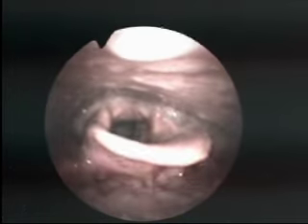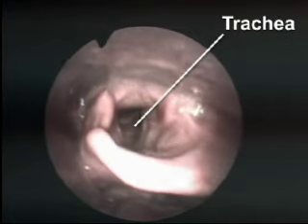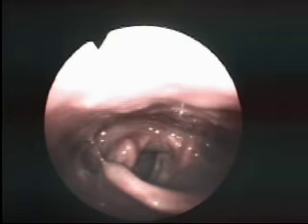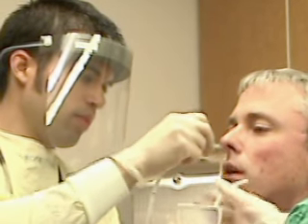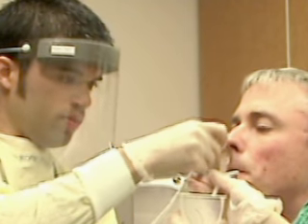As the tube reaches the level of the larynx, advancement is temporarily halted. The tube is then inserted as the patient swallows, and once past the larynx, is rapidly advanced. Note that in this endoscopic view of the larynx, the trachea is frequently open and may be accidentally intubated with an NG tube. Note also that as the patient swallows, the laryngeal apparatus rises and the epiglottis covers the glottis, preventing tracheal entry. Once past the larynx, the tube may be inserted rapidly to the predetermined depth. Check the black markings on the tube to confirm proper depth of insertion.